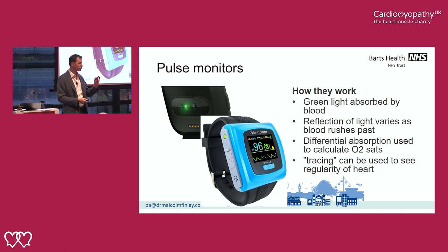They're pretty good at screening. So if someone has one of these things and it shows something, it gets you to go and see a doctor, but they're limited in diagnostics. You can also get the blood oxygen levels from these. They seem to be pretty accurate, actually, and they use a slightly different way of doing it than the classic red ones on the finger.